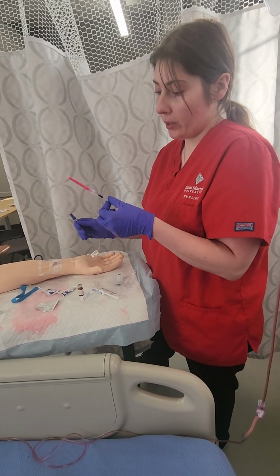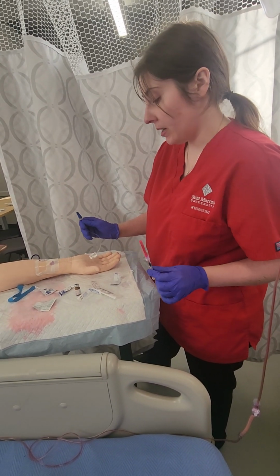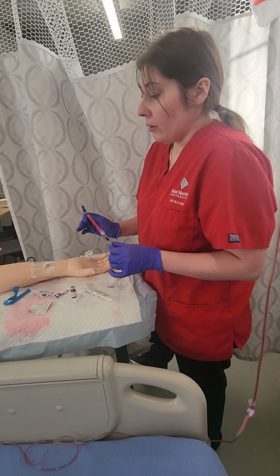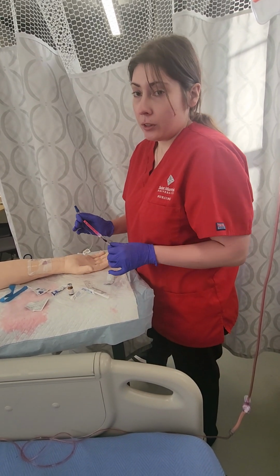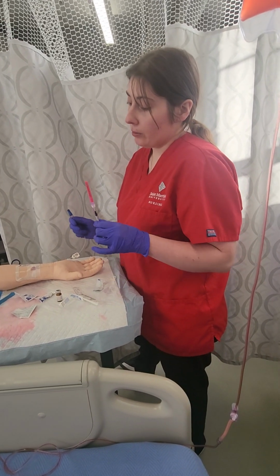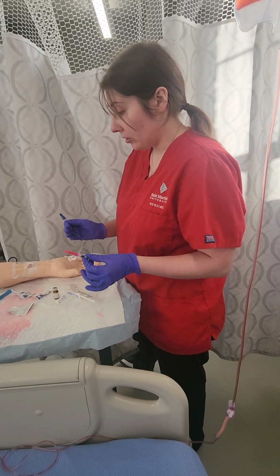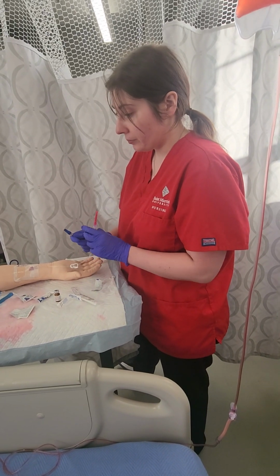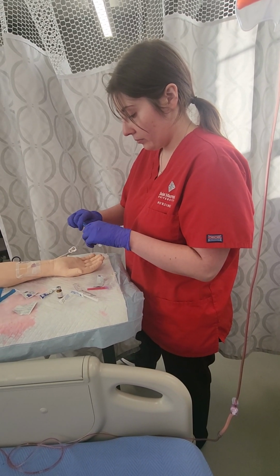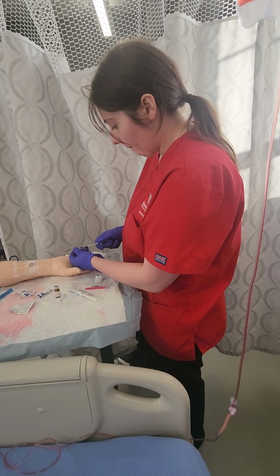So I have 0.3 milliliters to equal 3 milligrams of morphine sulfate for Mr. Scott. For the right route, which is IV, for his pain, 6 out of 10. And the time, he hasn't had it in a long time, so he's due for it. Okay.